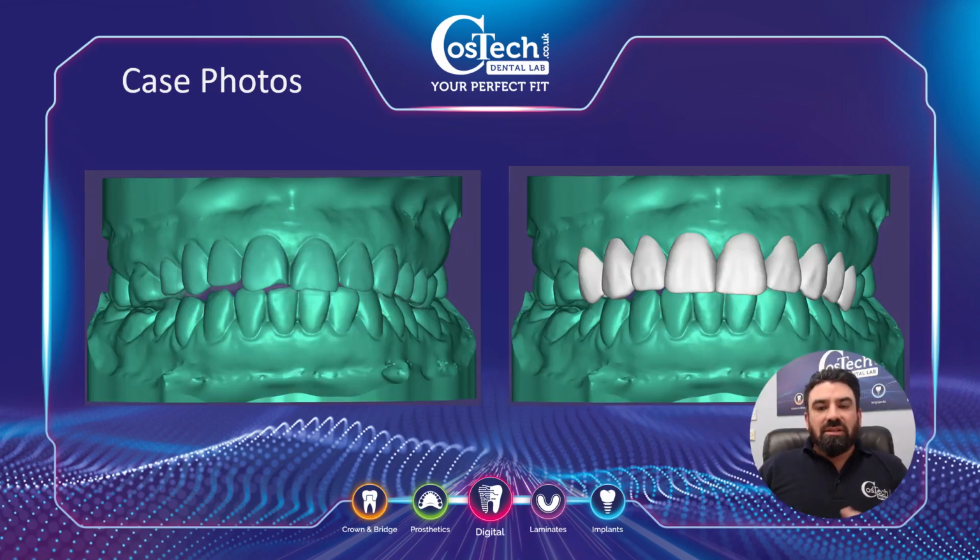So this is an idea of what happens on the system. When we have the case, we can provide the mock-up on the right hand side, and you show it to the patient, and they'll say, okay, that's exactly what we want, or actually, can you make this change. Again, the more input you give us, the better, because the patient will be happier with the final result.